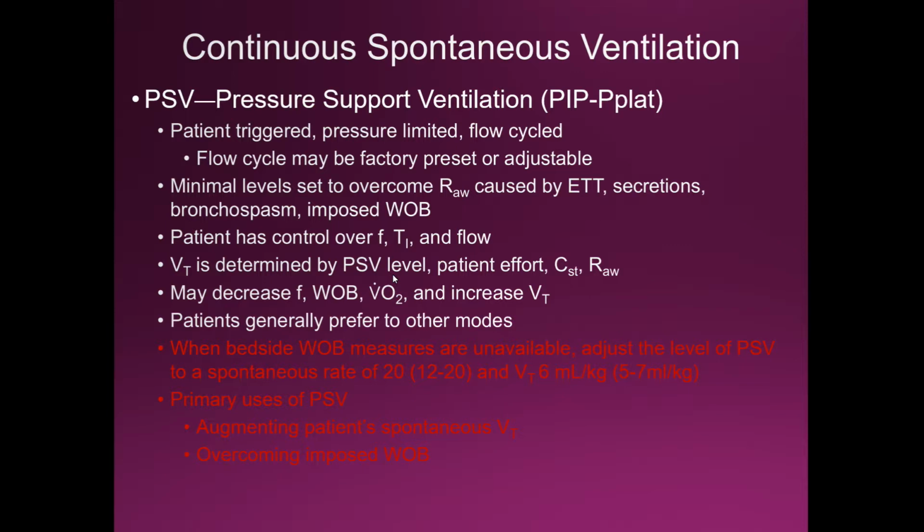Don't say IPAP is, because if you say IPAP is 12, EPAP is 5, I'm thinking you're talking about a patient on BiPAP. If you use peak inspiratory pressure or PIP and you use PEEP, I'm thinking you're talking about a mechanical ventilator, okay? An invasive mechanical ventilator.